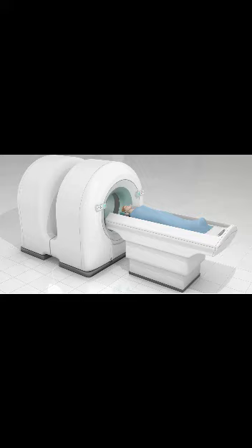Can inflammation be seen on a PET scan? In inflammatory diseases, 18F-FDG PET also has its value, particularly in atherosclerosis and some arthritis diseases. However, 18F-FDG PET imaging of inflammation tends to give false positive results, especially in patients with cancer.